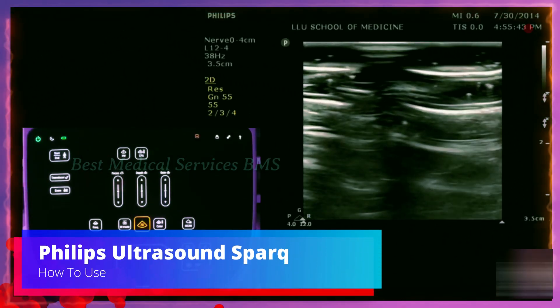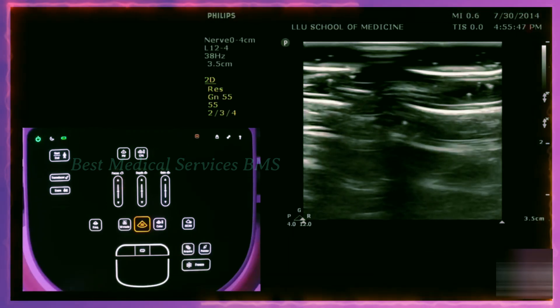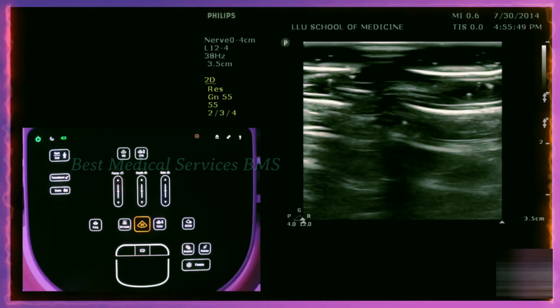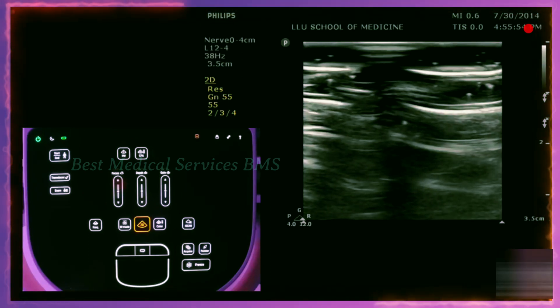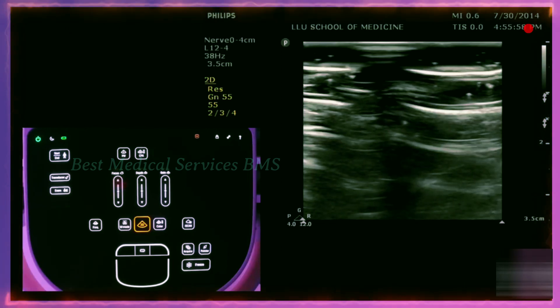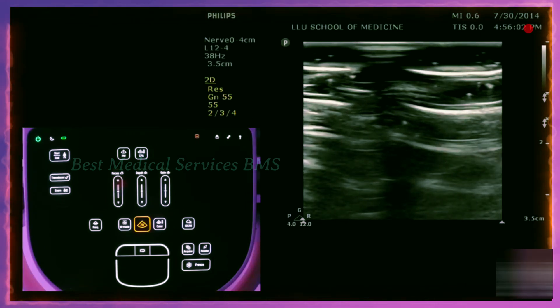In this video, we're going to go over how to use the ultrasound machine. Every machine is going to be a little bit different, but the basic functions are going to be the same for every machine — you just have to find out where the buttons are. For this machine, it's a Philips Spark machine. First thing you want to do is select the correct transducer.